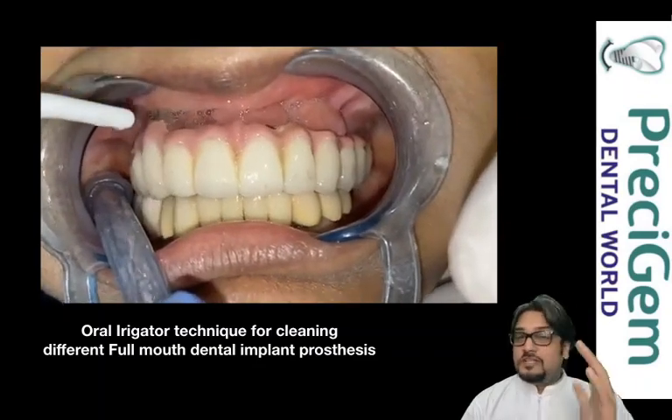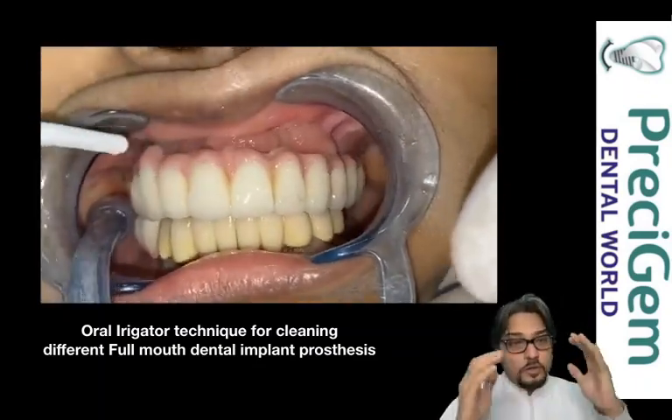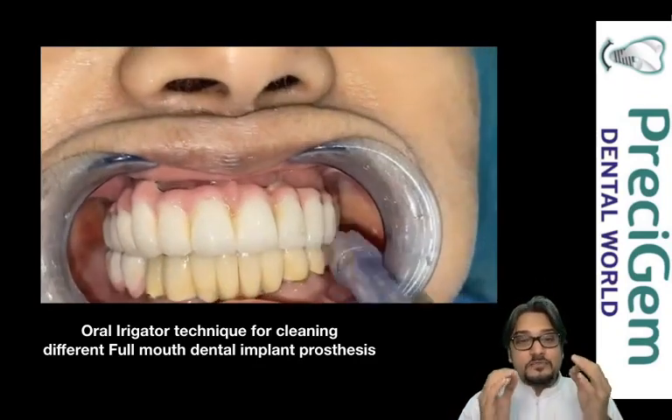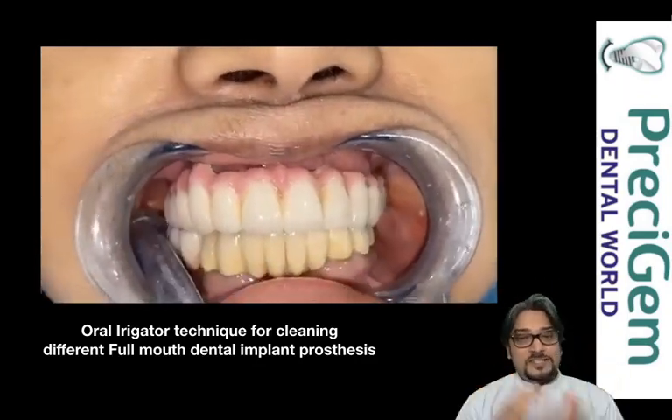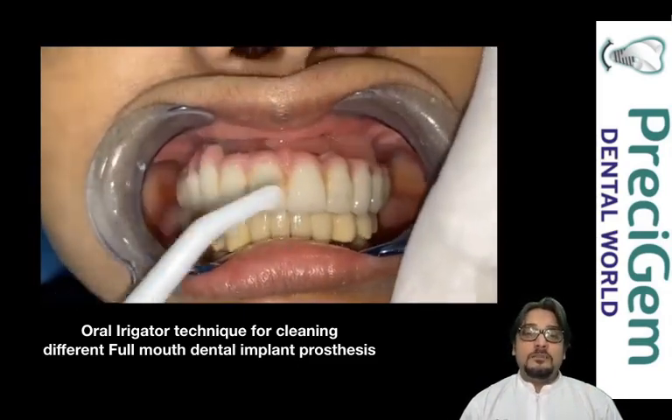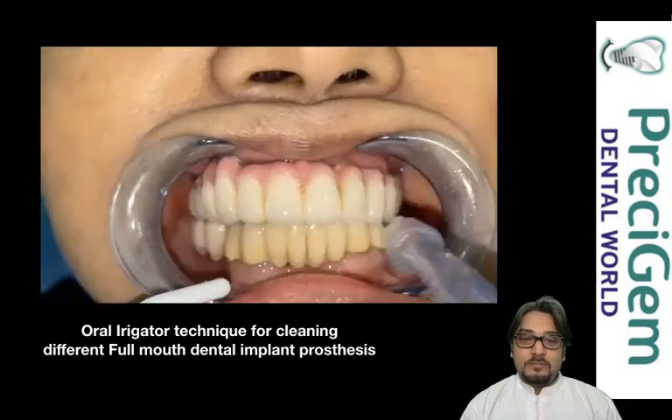Now this is the FP2 prosthesis — I mentioned that a lot of spaces are present where food may get lodged. It is very easy to clean such areas with an oral irrigator, and that will definitely improve your implant survival rate because your cleaning will be thorough.